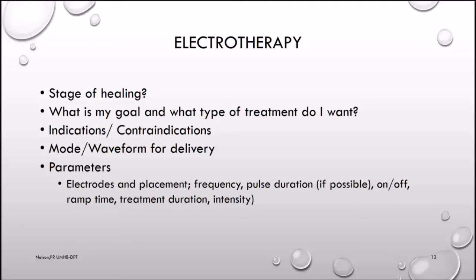What are the indications and contraindications? Be sure that your patient really is ready for electrotherapy. You'll choose your mode or your waveform that you're going to have for delivery of that therapeutic dose. And then you have to then choose your parameters. So hopefully this brief review has given you a little more confidence in choosing parameters based on your therapeutic goal.